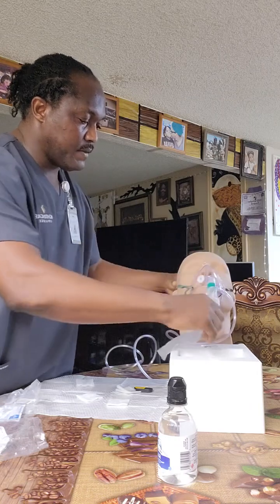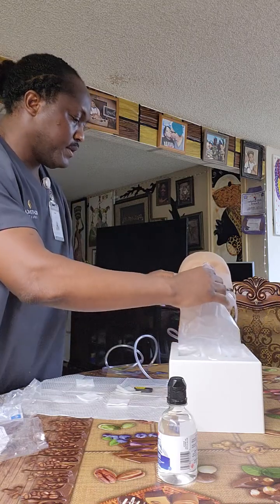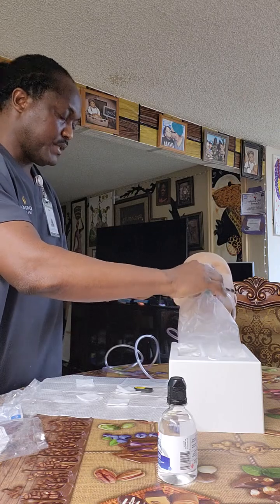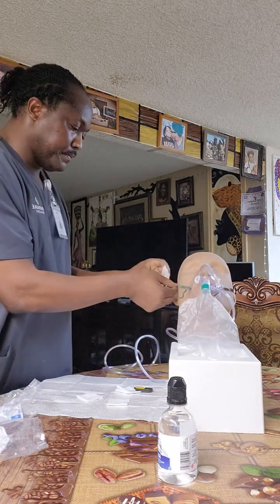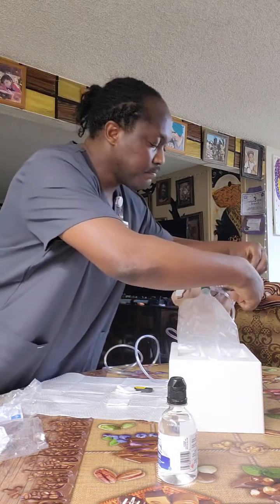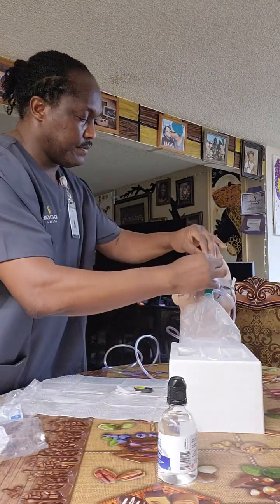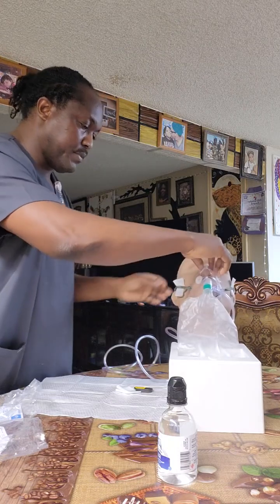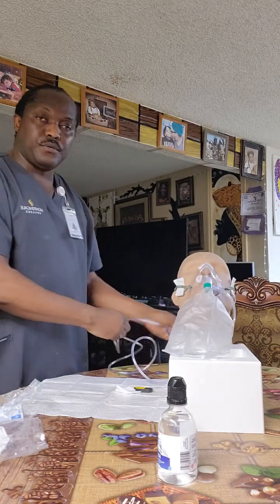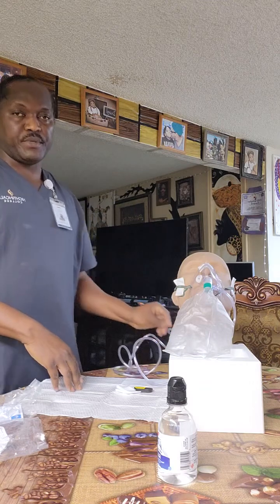Ensuring the patient is okay. And usually these are very uncomfortable around the cheeks and the ears, so I'm going to put some padding on the cheek and on the nose, ensuring that the patient has some comfort. Then I'm going to set the oxygen to 15 liters per minute per the doctor's prescription.